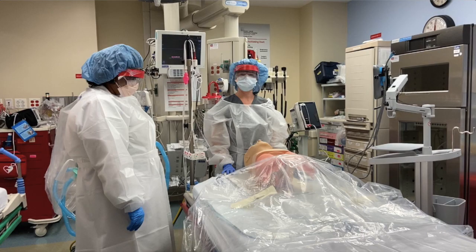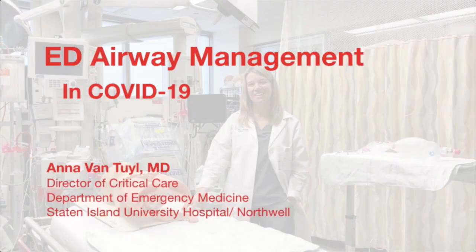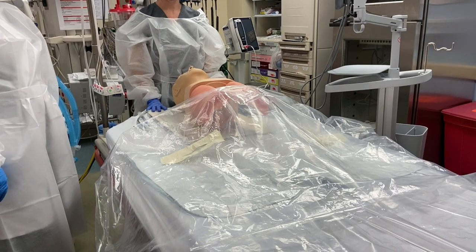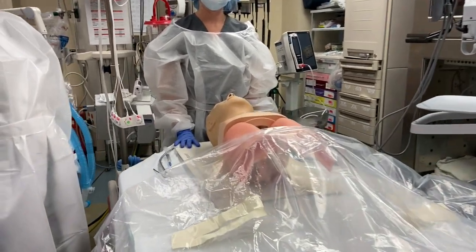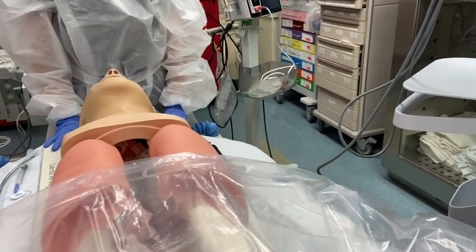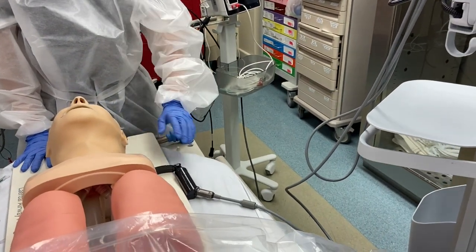This video is to demonstrate the use of a fenestrated drape in the COVID-positive or COVID-suspected patient. First, the patient is prepped as per the prior video on ED airway management in COVID-19. Next, in preparation, the fenestrated drape is placed on the patient to be later unrolled. To the right of the operator is the ET tube and 10 cc syringe, and to the left, the laryngoscope.